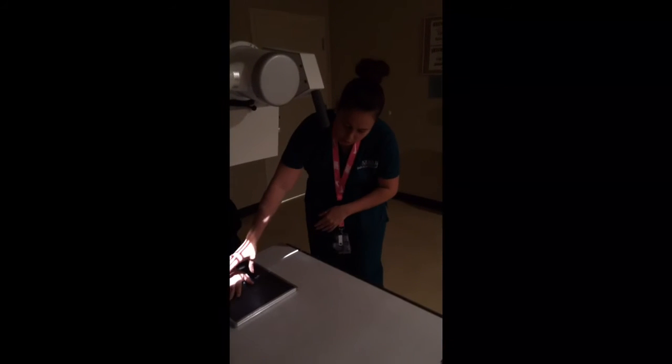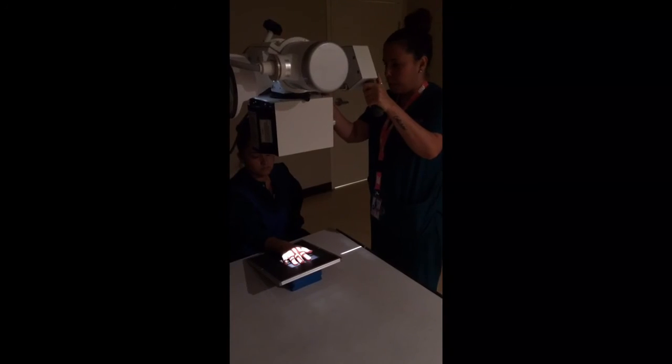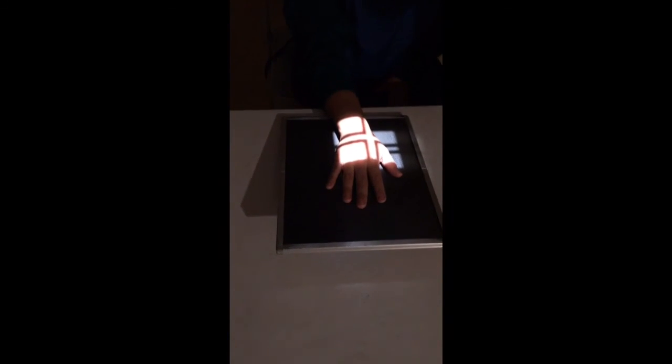If patient condition does not allow for the patient to be able to deviate their hand that way, we have another option, which is called the modified Stecher. In this case, what we can do is we're going to go ahead and elevate the hand with a 20-degree sponge, which will also help that area to be visible. For this exam, the CR is going to be perpendicular, and we'll just go ahead and direct it towards the scaphoid region. The patient will not have to deviate their hand or move, because in this case, this is specifically for trauma.